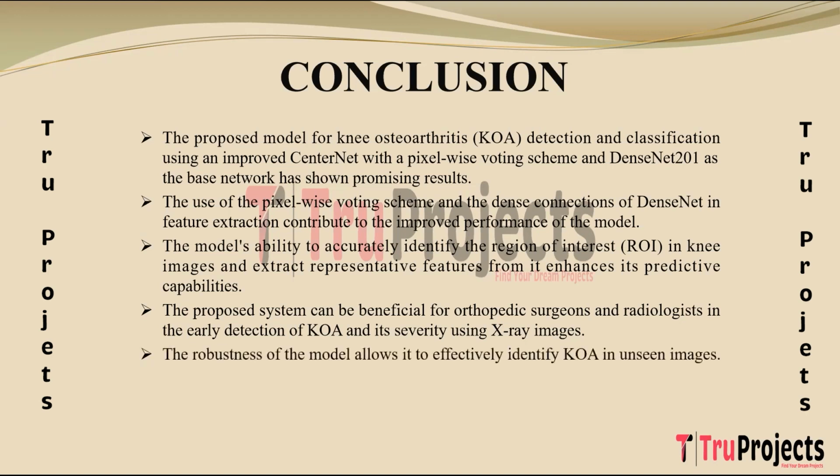The robust nature of the model allows it to generalize well to unseen or new knee X-ray images. Its ability to accurately identify KOA-related features in previously unseen data indicates its potential for practical deployment in real-world scenarios.